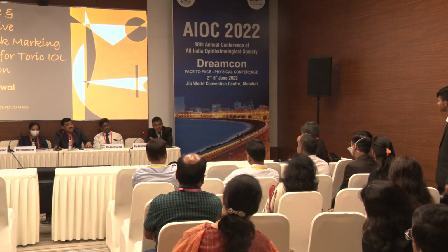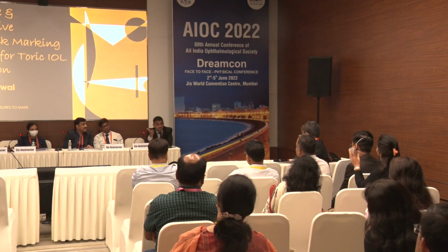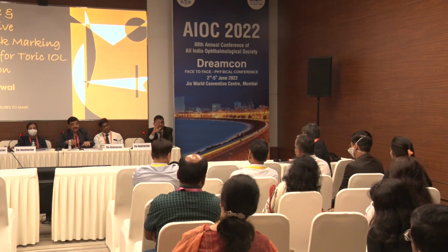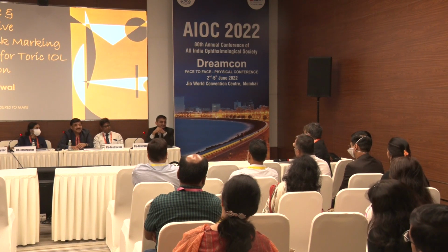Even then, if you're going to rely on one machine, I showed you in the data that even the IOL Master may not match with your manual keratometry, and the manual keratometry may be right. So what I'm trying to say is that the axis, from an optical biometer, should ideally be referred from a topographer or a tomographer. The IOL Master reasonably gives a good axis. The question is not which one gives the best, but whether you get consistency between the two. That's the main idea.